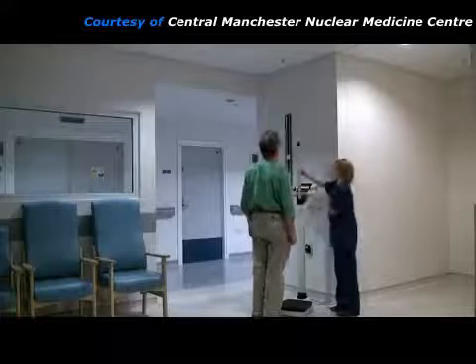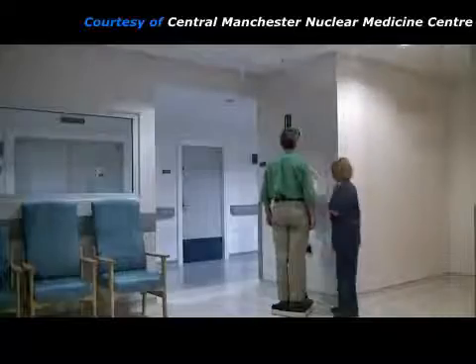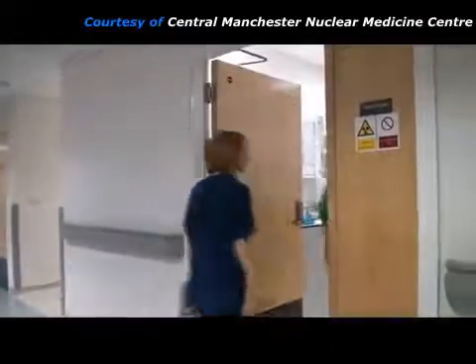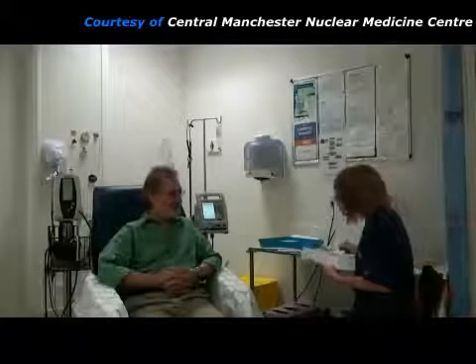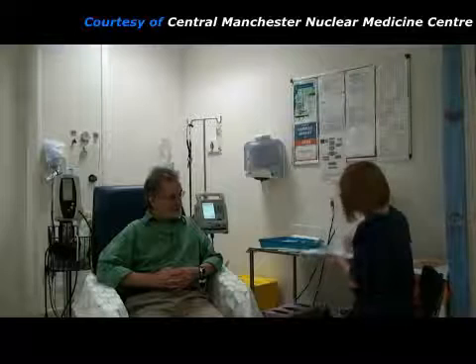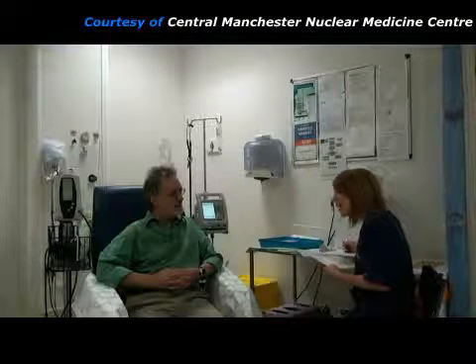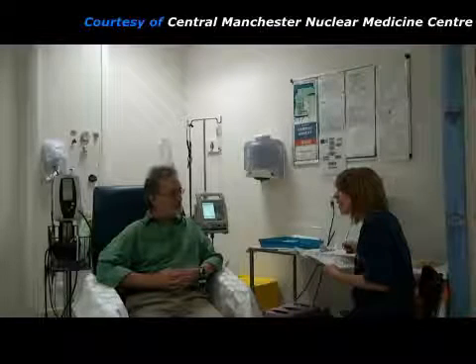The practitioner measures the patient's height and weight so that she can calculate the correct amount of radiopharmaceutical to use. They then go to the stress room, where the practitioner checks the patient's identity to make sure she has the correct details. She asks the patient about his symptoms and checks that he has remembered any instructions about not drinking tea or coffee before the study. Then she explains what will be happening during the procedure and answers any questions he might have.